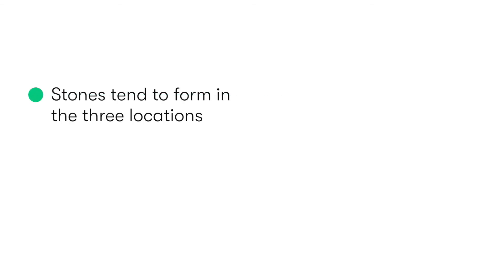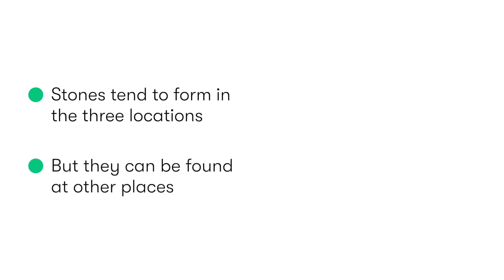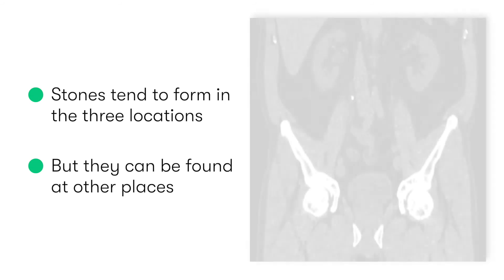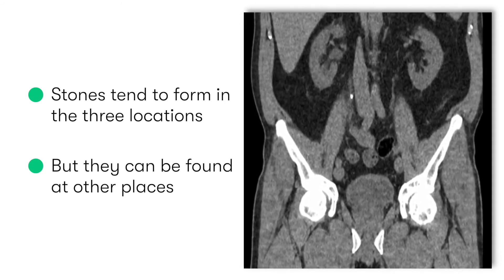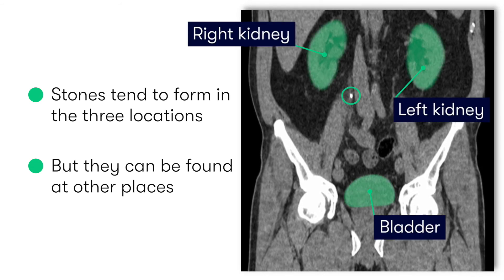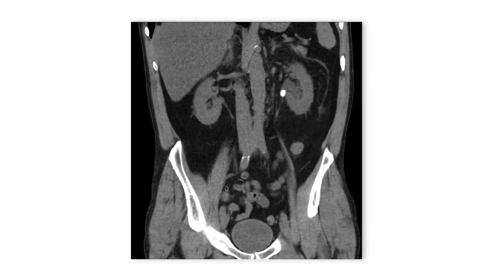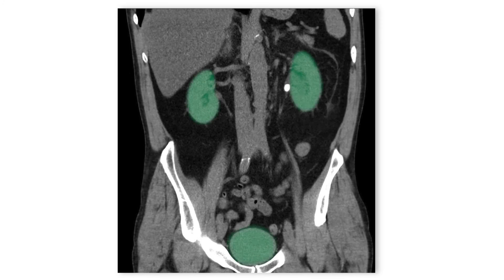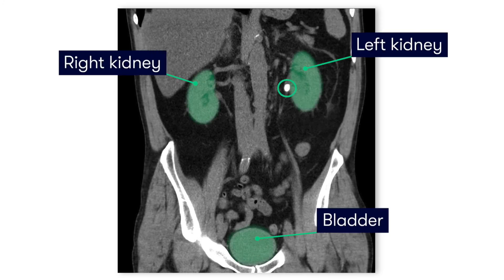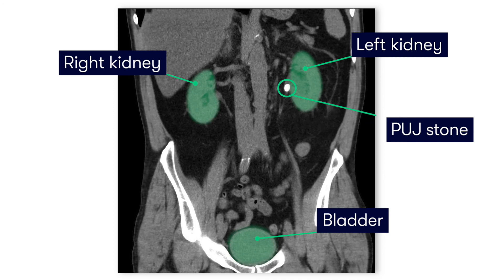There are three common locations along the urinary tract where we tend to find urinary tract calculi, though in some instances we do find stones in other locations. As we can see in this CTKUB, we can identify a calculus that's lodged in the proximal to mid ureter. In this CT scan, if we focus on the left kidney, we can see a sizeable and fairly obvious stone that's become lodged at the left pelvi-ureteric junction, or PUJ, which is one of the three common locations where urinary tract stones tend to become lodged.